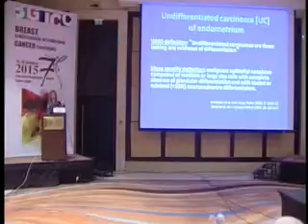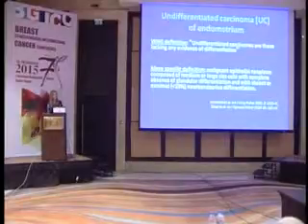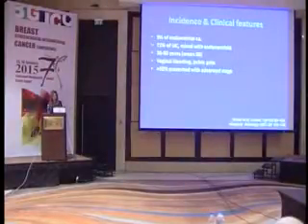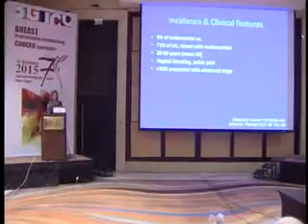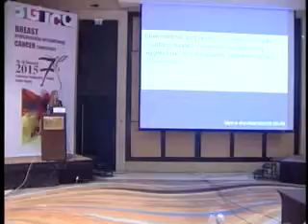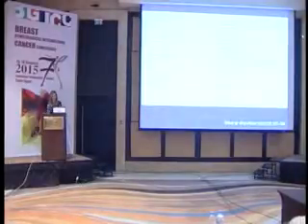what, I mean, I won't worry you more with the whole thing, but you might see very rare, less than 10% neuroendocrine features, and this is why the chromogranin and the synaptophysin were focally positive. The incidence is very, very rare, a vanishingly rare tumor, but it occurs. And Dr. Robert Soslow from Sloan Kettering was one of the pioneers describing it in a larger series.